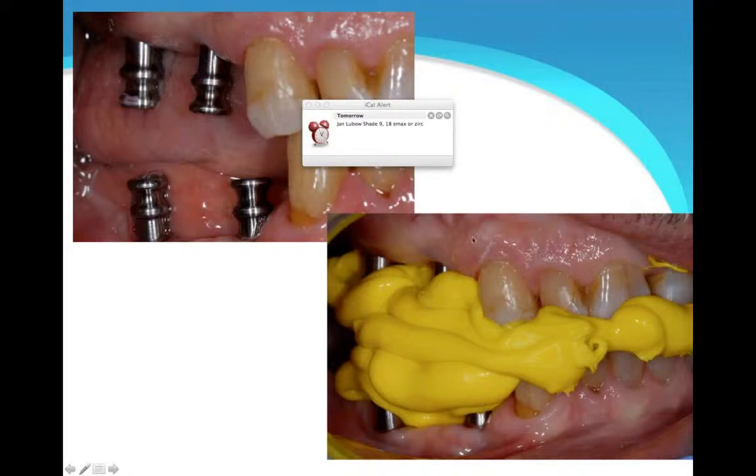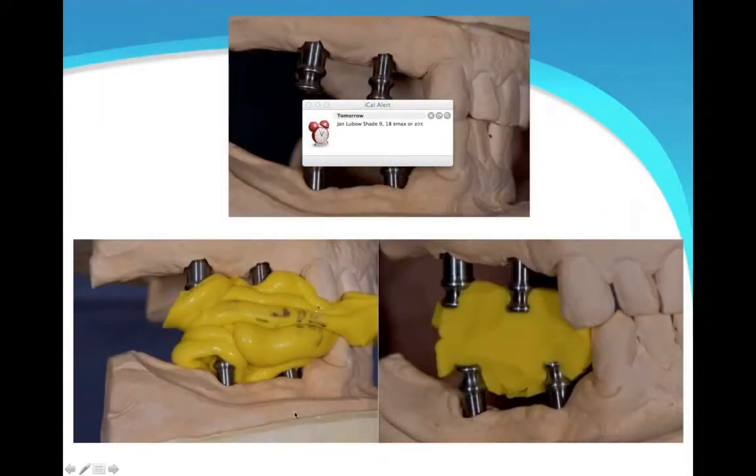This case is Dr. Dan Clater in Colorado. It's a real case for sure. Now we've reduplicated this right on the model. So we screwed them into the model. Remember this, that laboratories sometimes don't screw directly in. The hole just needs to be reamed out a little bit. We'll go through that more.